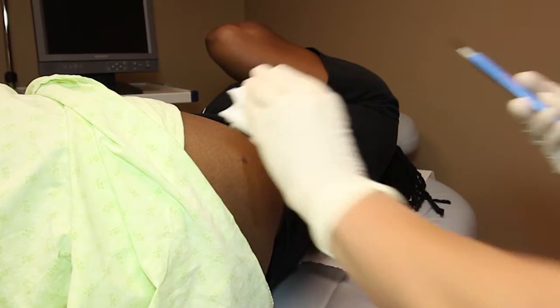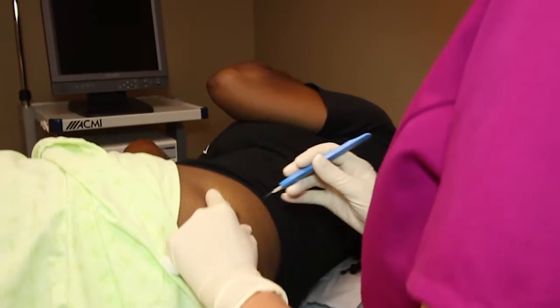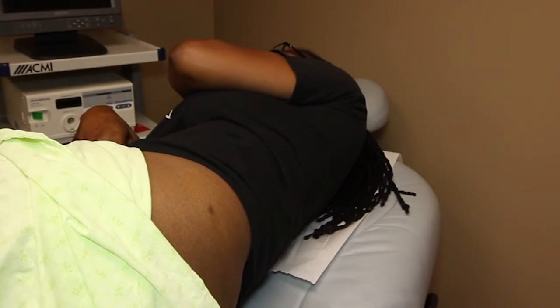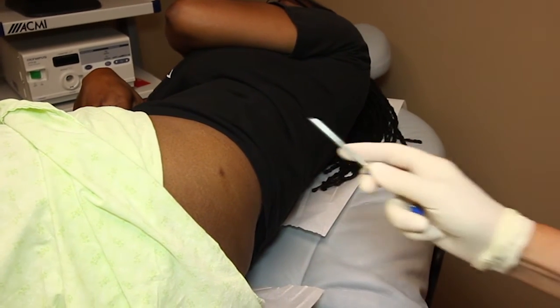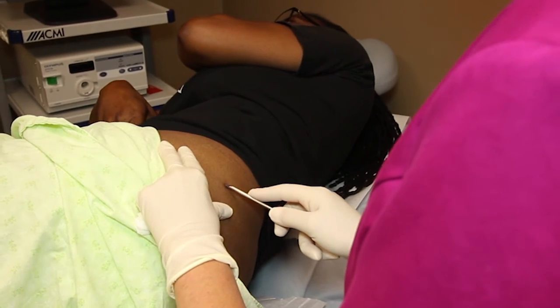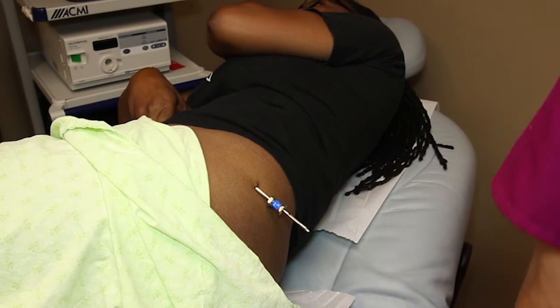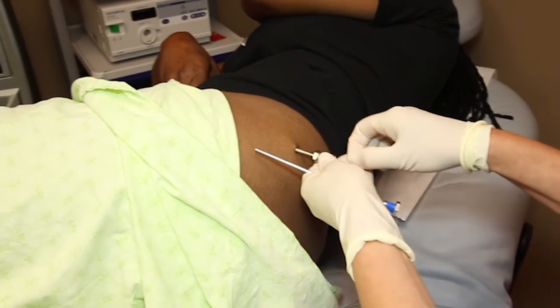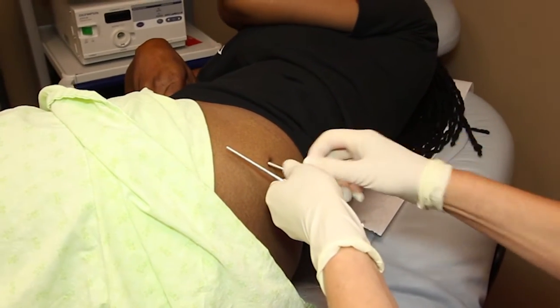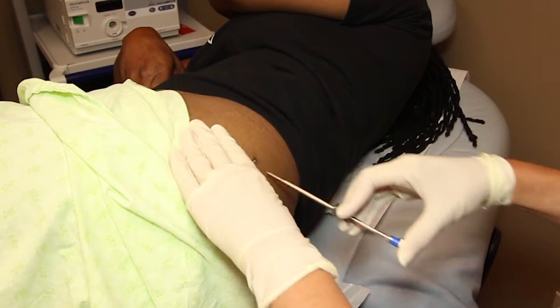I'm putting on sterile gloves now, and I'm going to make a tiny incision. Then I'm going to place the trocar underneath the skin and load up the pellets. I'm using 50 milligrams of estradiol and 50 of testosterone. I'm going to drive the pellets in and remove the trocar.